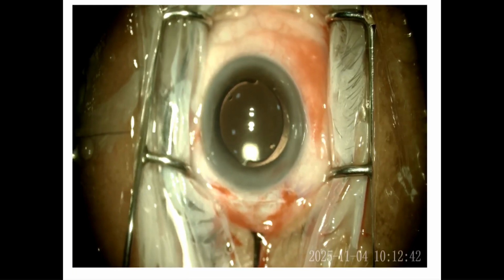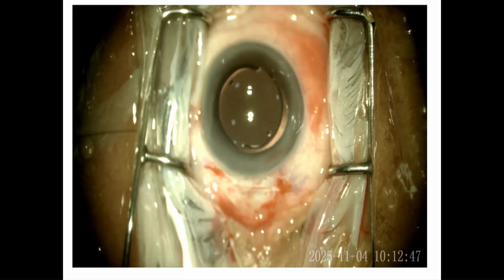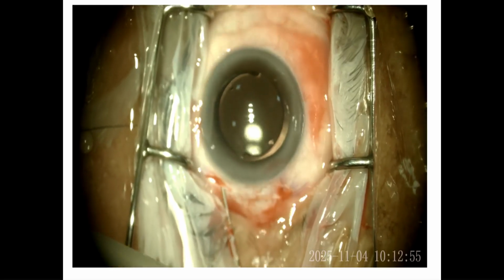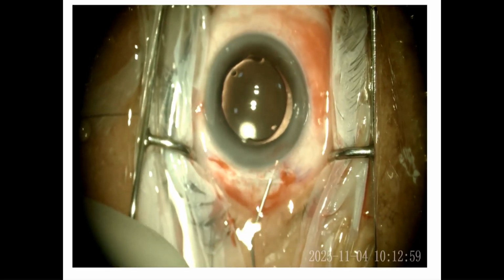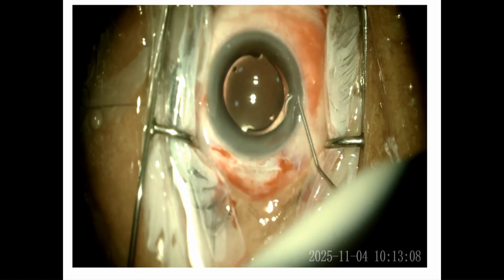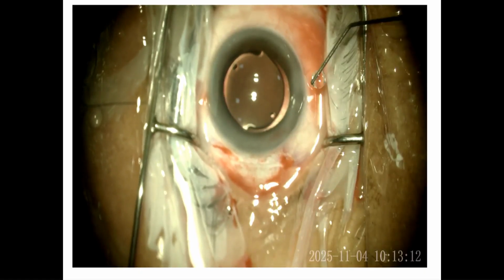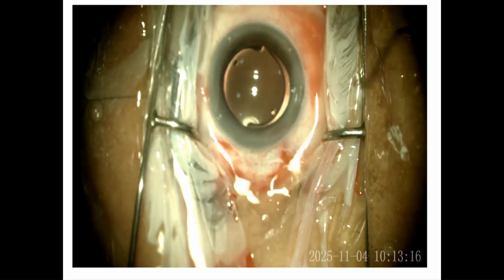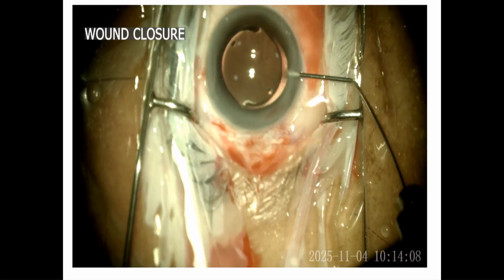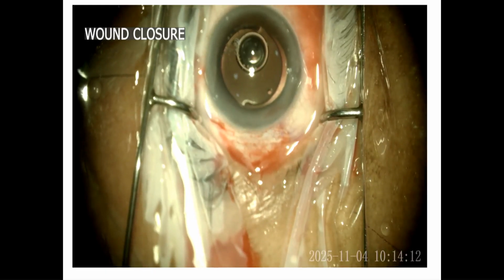So after that you have to form the AC. You can see the stretch lines over the posterior capsule that indicate the in-the-bag IOL implantation. Then just swipe through the tunnel to make sure there are no nucleus remnants in the tunnel. And the side port is hydrated. Make sure the wound is tight and there is no leak. All right, you can just tap on the dome of the cornea and also on the incision site and make sure there is no leak.